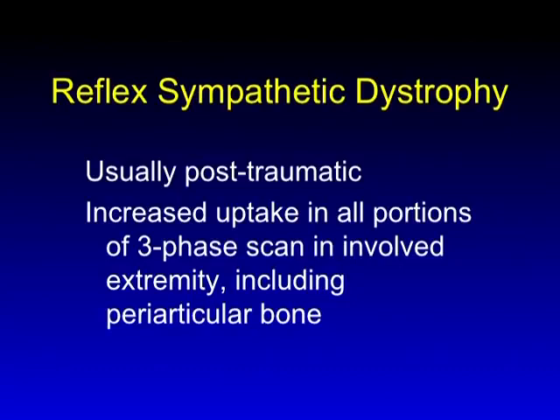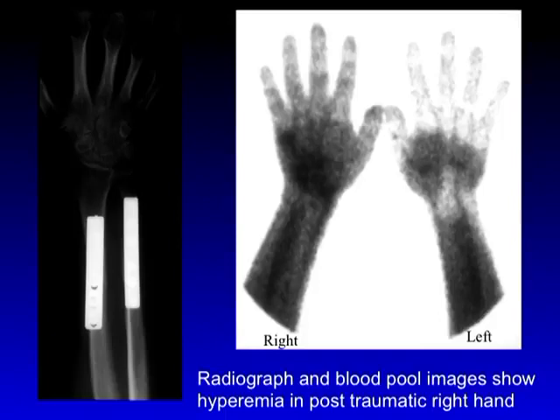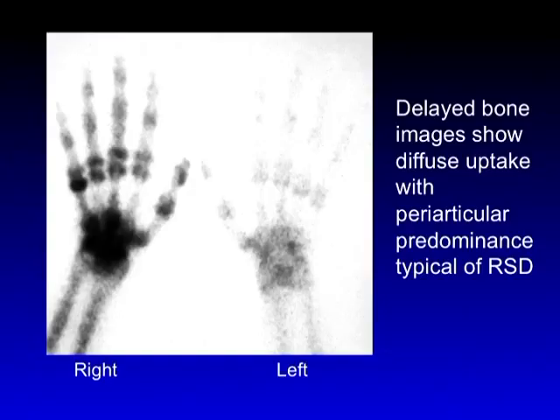Reflex sympathetic dystrophy, often today called complex regional pain syndrome, is usually post-traumatic and shows bone scan abnormalities early on in all three phases of the bone scan, especially involving periarticular bones. It typically involves a distal extremity. Here we have a patient with profound osteopenia of the hand and wrist after forearm fractures. Note that the right hand is diffusely hotter than the left, with some focality particularly in the carpus and metacarpals. The delayed bone images show the whole hand is abnormal — a periarticular and diffuse abnormality that is the very classic appearance of RSD. It usually involves all of the rays, although sometimes only a couple.